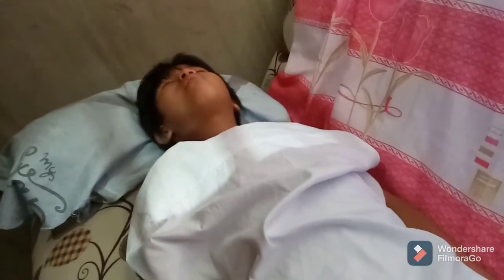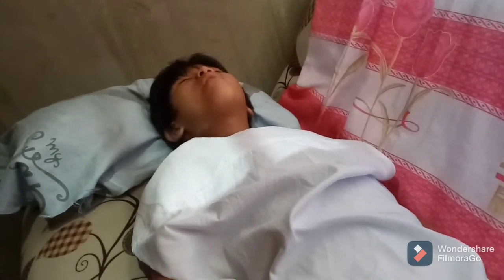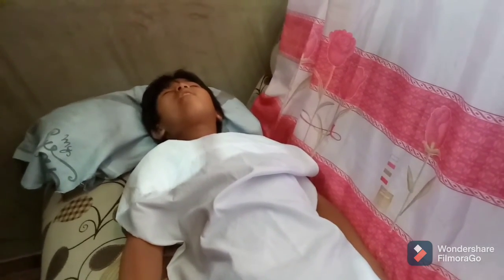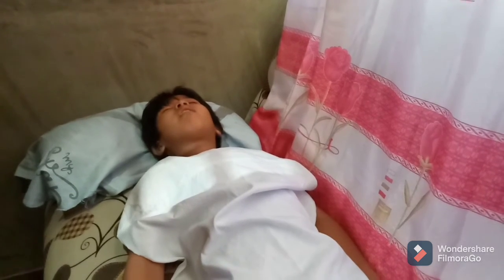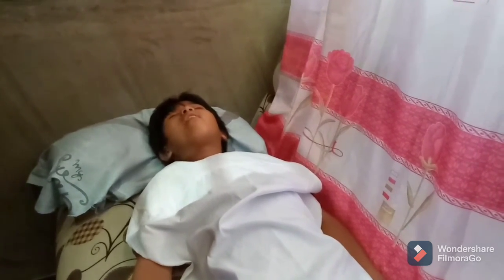For respiration, suspend respiration, and the patient should not swallow during the exposure. For the evaluation criteria of this procedure, the anatomy demonstrated must be cervical 3 to thoracic 2 vertebral bodies. The spaces between the pedicles and intervertebral disc spaces must be clearly seen.